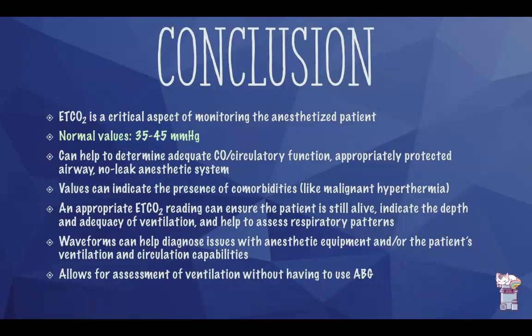An appropriate end-tidal CO2 reading can ensure that the patient is still alive. It can indicate the depth and adequacy of ventilation and help to assess respiratory patterns. Different waveforms can help diagnose issues with the anesthetic equipment and/or the patient's ventilation and circulation capabilities. This allows for assessment of ventilation without having to use invasive methods, such as arterial blood gas monitoring.